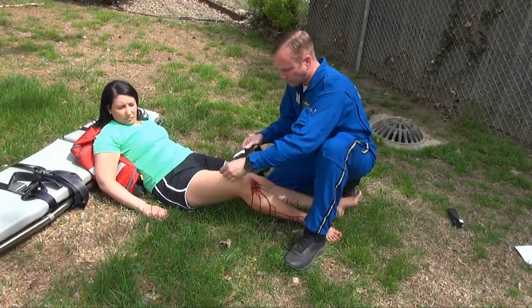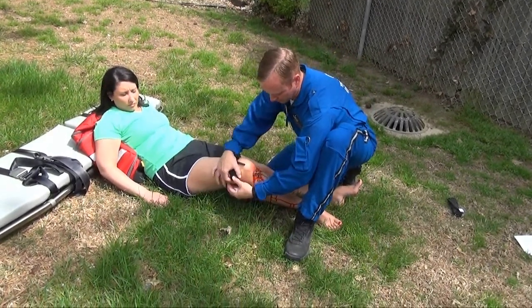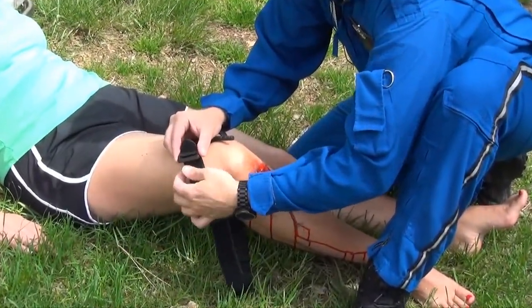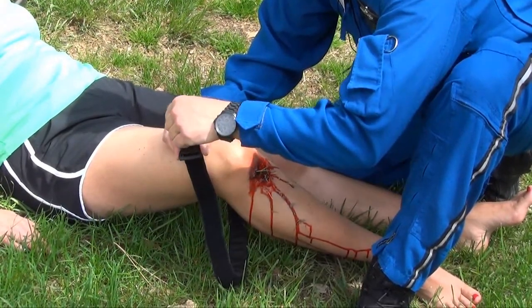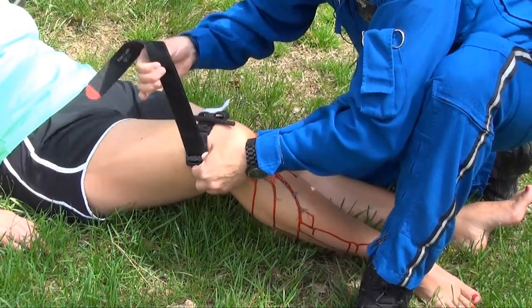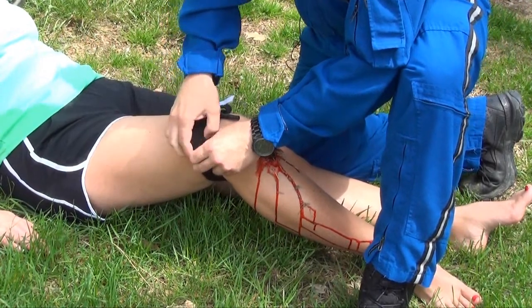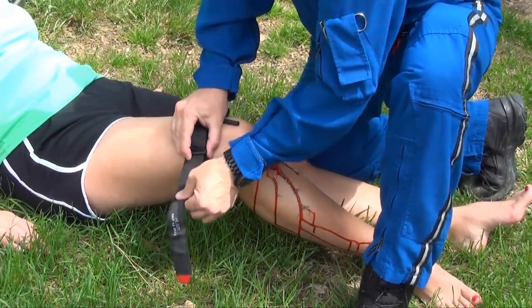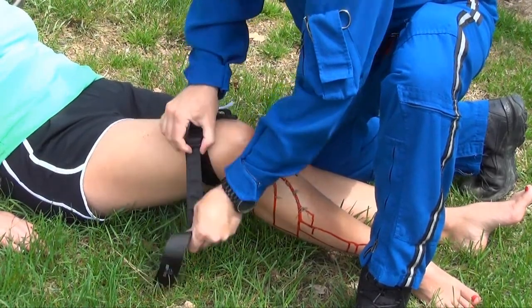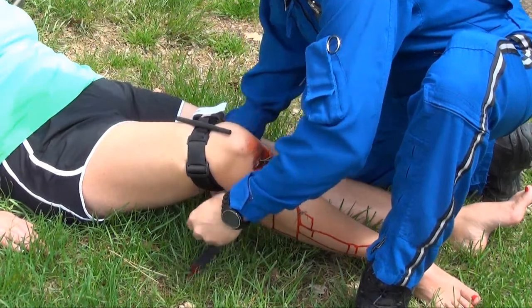By starting out, you want to place the tourniquet around the extremity proximal to the wound. Take the tab of the strap, slide it through the slit of the friction buckle on the inside, and pull it tight. Then take the tab of the strap, slide it through the outside slit of the friction buckle, and pull it as tight as you can, securing the strap to itself.